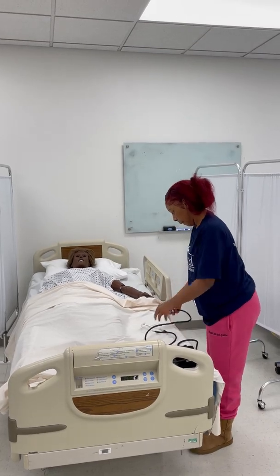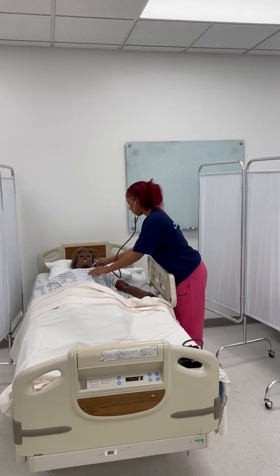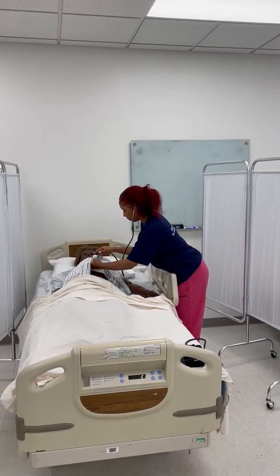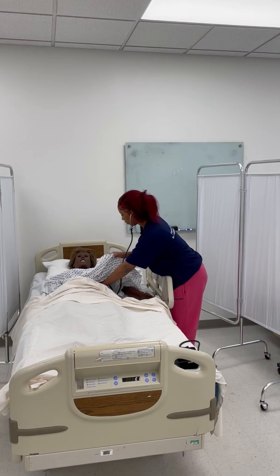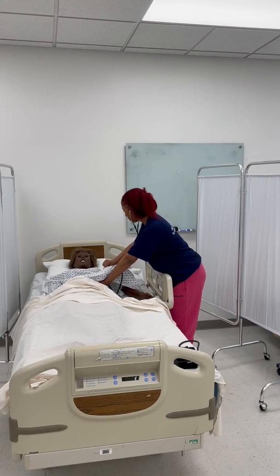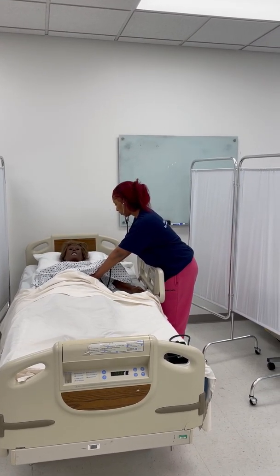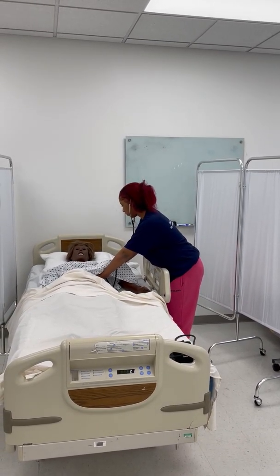So during that 2-minute wait, she will check the apical pulse, which can be found at the left fifth intercostal space in the midclavicular line. She will count this pulse for 1 full minute. When she has completed this pulse check, she will then check the patient's respiratory rate, leaving the stethoscope on the patient's chest so that the patient does not know that she is counting her respirations.